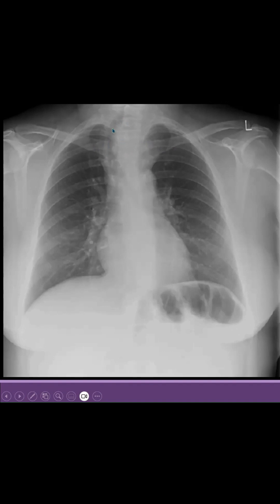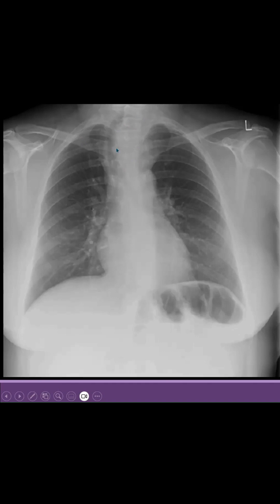And if you can see the trachea as well, the trachea is shifted or pushed towards the opposite side. So most likely there is something here which is pushing the trachea towards the opposite side. Because the lungs are normal, they cannot pull the trachea. If there is fibrosis, we say that there is a collapse or fibrosis which is pulling the trachea towards the side. But the X-ray is normal, so it means there is something here which is pushing the trachea towards the opposite side. So this is part of the superior mediastinum — this is widening of the superior mediastinum.